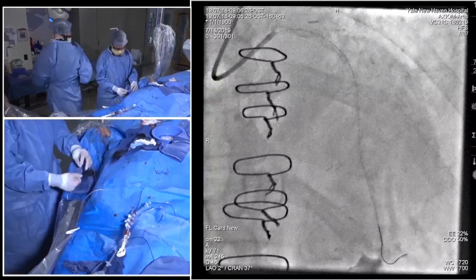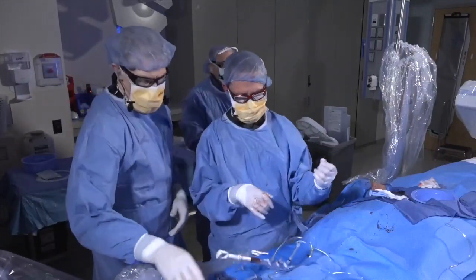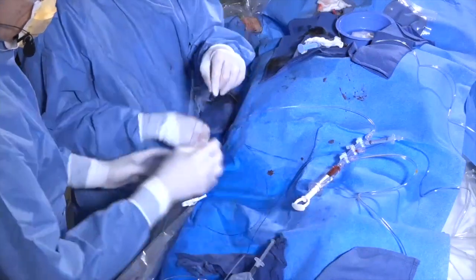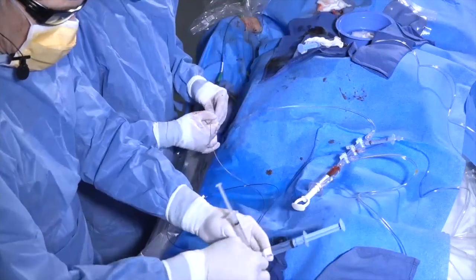But I've seen a couple of cases where people have really mangled a FineCross with a rotablator, and so I've gone to using a Corsair catheter, and will probably end up going to the new Corsair extra small, because I think it'll fit better.